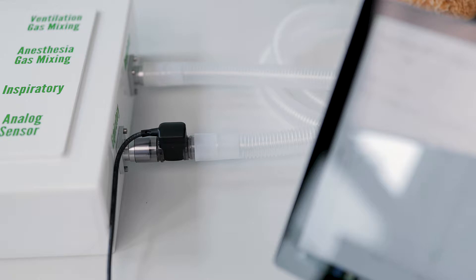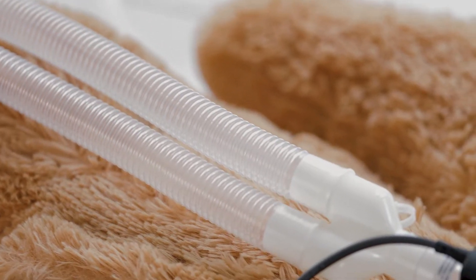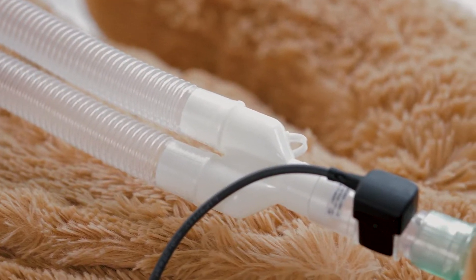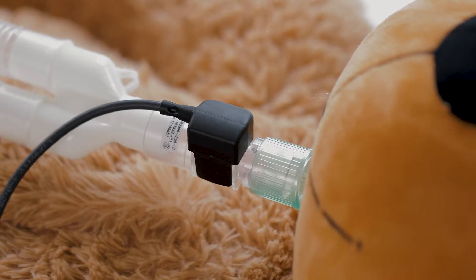Today we'll be looking at expiratory flow measurements, the challenges in this field and the sensors you can benefit from. Here's the issue: the air in the expiratory limb is warm, humid and could be contaminated with bacteria and viruses carried by the patient.